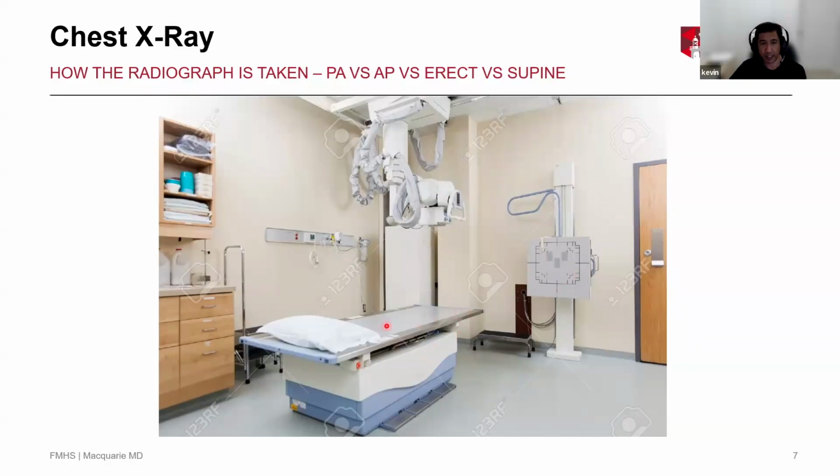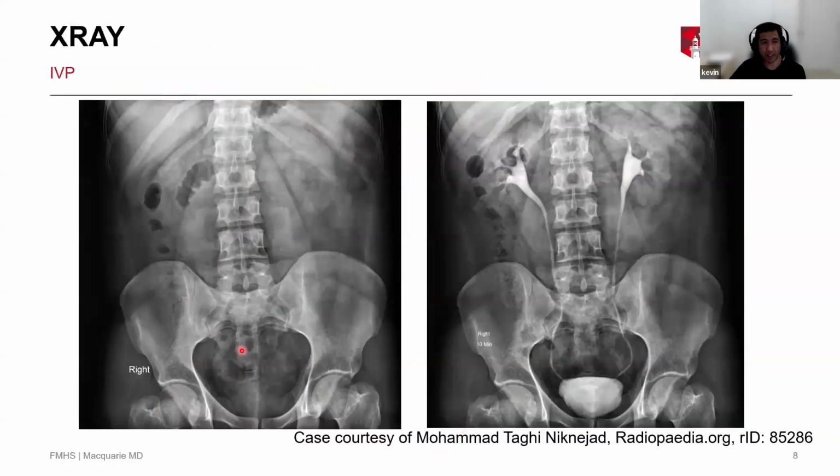But by and large, imaging the abdomen, you'd have the plate underneath the table and the X-ray source above it. Okay, so that's the basic configuration, and you get an image that looks like this. So if you look at the image on the right, you can see bone, you can see a bit of bowel gas. So gas is less dense, so it looks darker, and so it's like a negative contrast.